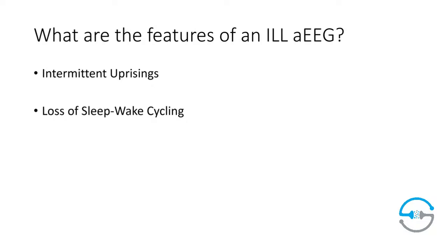So they're plugging along on PGE, they have low mixed sats that we are expecting, and when you monitor them with aEEG, they have okay background patterns, so their voltage is good, but the hypoxia just does not allow their brain to organize into that rhythmic sleep-wake pattern that you would expect for their age. And it's just one of the hallmarks that I've seen over the years of this loss of cycling. So this to me begins to tell me that the brain is not tolerating that level of hypoxia, and that maybe it's time to have a conversation about that.